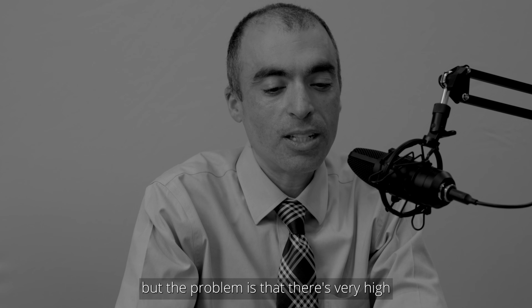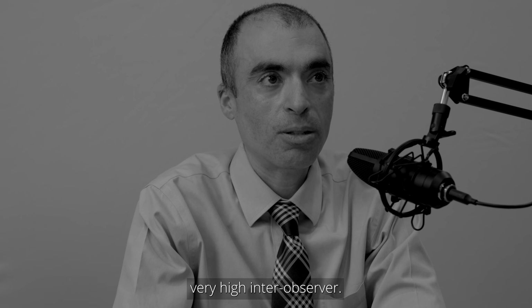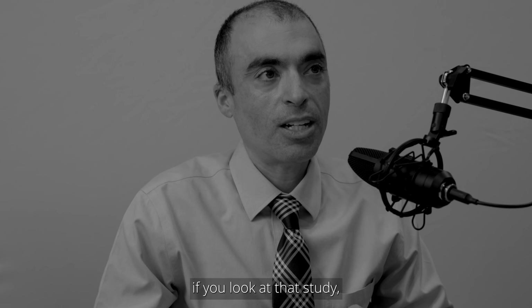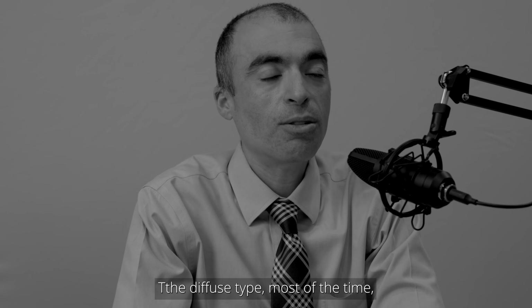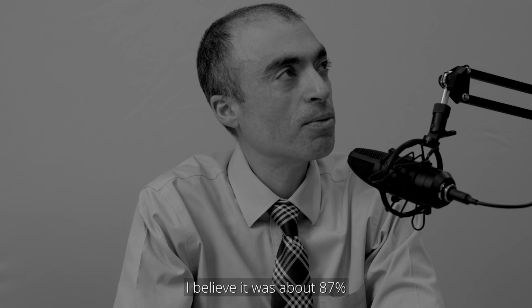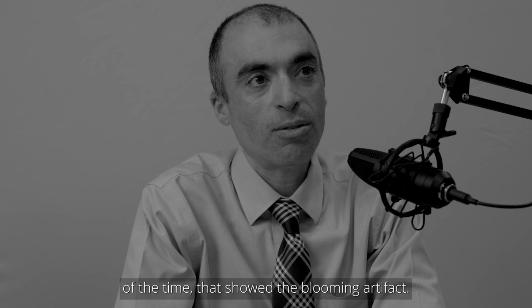But the problem is that there's very high inter-observer variability, and the other thing is that with the nodular type, if you look at that study, less than 50% of the time did they deem that it was blooming. The diffuse type, most of the time, I believe it was about 87% of the time, showed the blooming artifact.